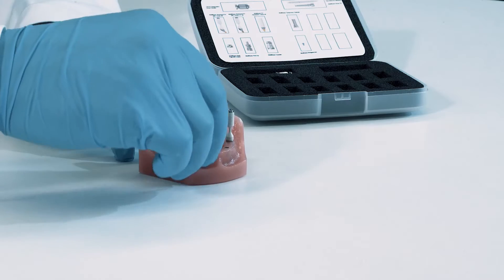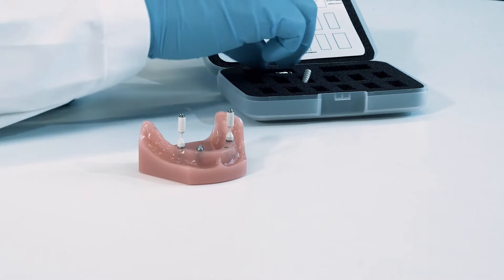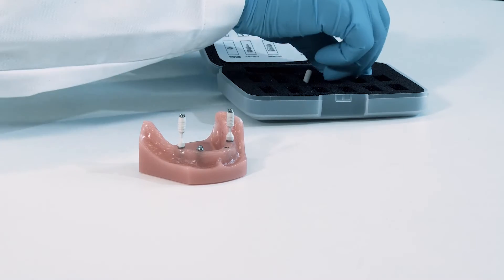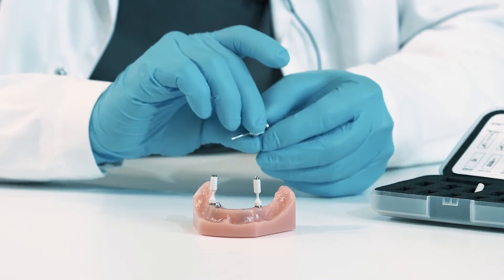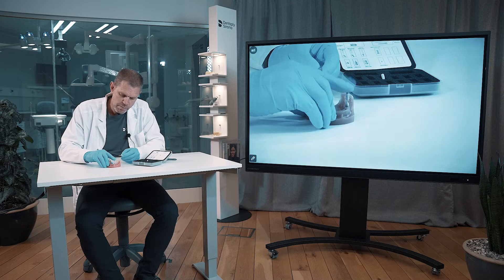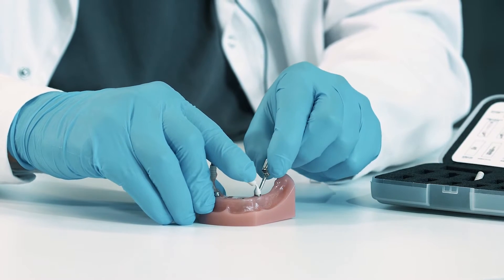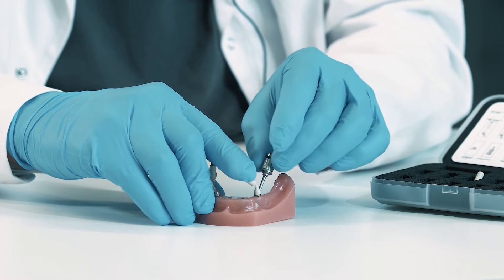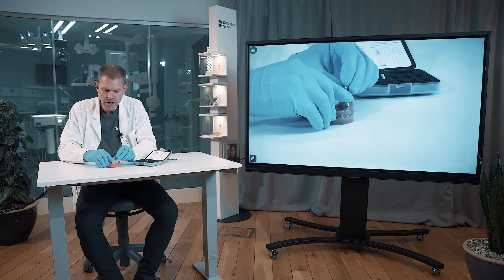The first one here, I just snap off. That's the easy one. The two remaining, I have to tighten with my hex driver. And there is a little trick here — you can bend this part here to have better visibility. And especially if you are a doctor, this part is really good so that you have full control of what you're doing.